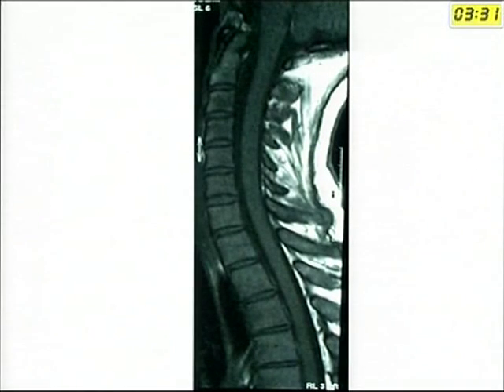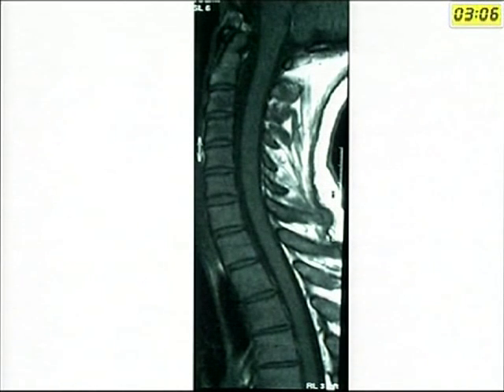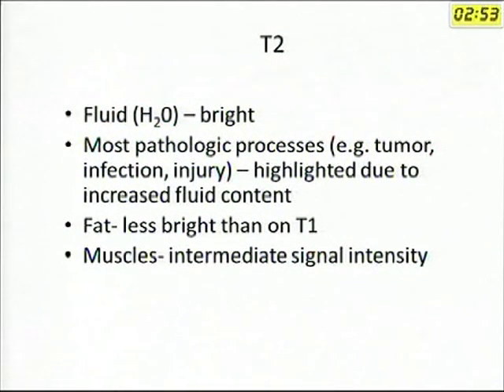How do you know if an image is T1 or T2? Look at the CSF surrounding the cord. If the CSF is dark, it is a T1 weighted image. In T2 weighted images, CSF is white — water is white on T2, dark on T1. Anatomical details are better seen on T1 weighted images. On T2 weighted images, fluid is bright, and most pathological processes like tumors, infection, and injury are highlighted on T2 due to increased fluid content.